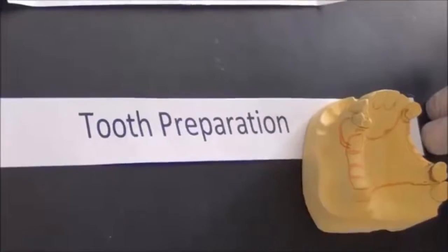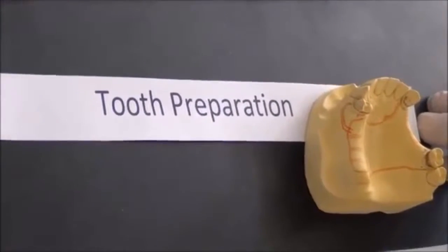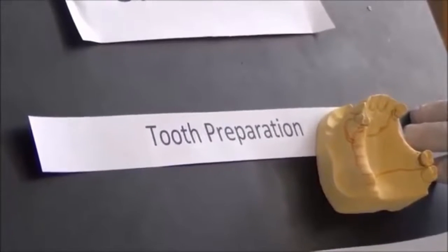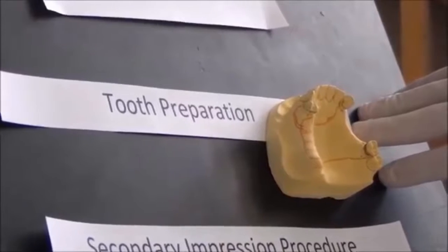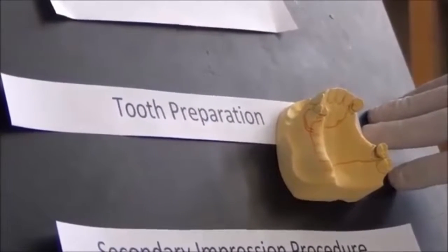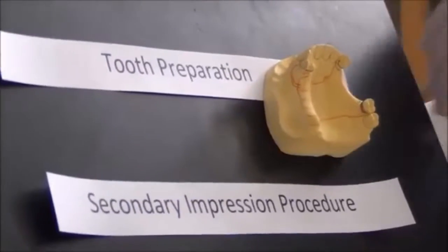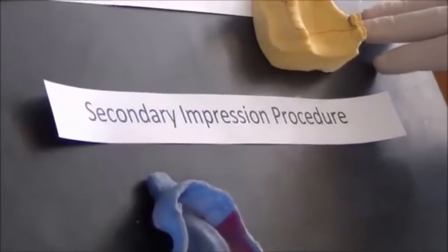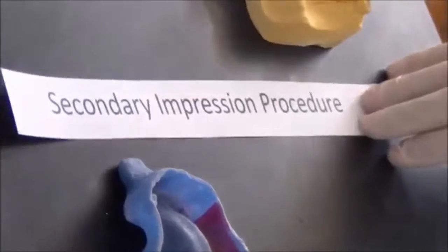preparation. I would like to remind you that the natural tooth form is smooth and continuous, but it does not have places to place a specific guide plane or rests. So we do tooth preparation to make the shape of the tooth accommodate components such as guide planes and rests. After tooth preparation is done and your supervisor approved these alterations of the teeth, a secondary impression is taken.